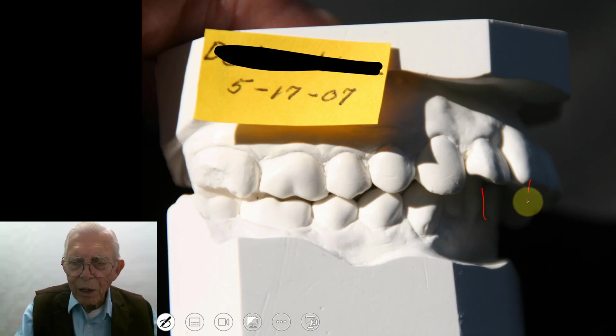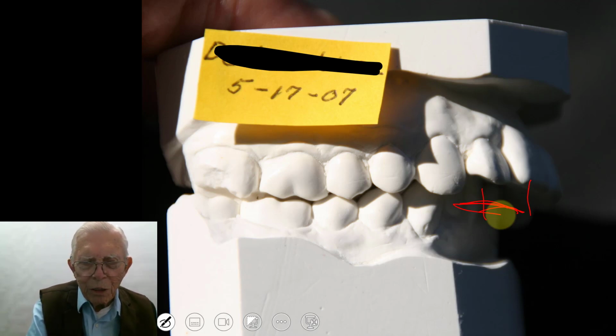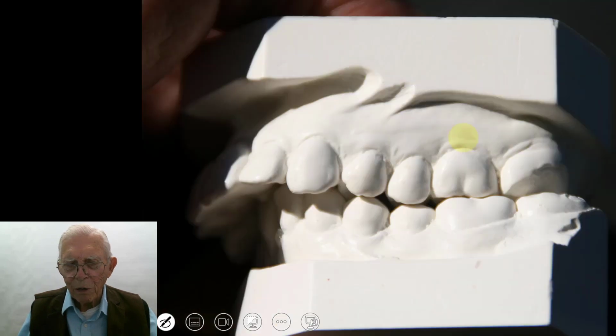But we've got a distance in here, and the person nearly always will have some kind of problem with pulling the lip back and putting pressure on it in here. And so if you're going to try to move, see, this jaw needs to have this tooth right here ought to be something like this. In other words, we need to bring this lower jaw forward, or bring this back to some extent, and have the two to get it corrected in here. So let's see what we do here, and I'll show you. Maybe you can carry on with it.